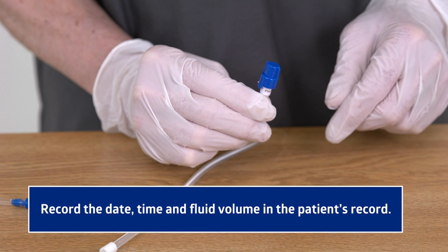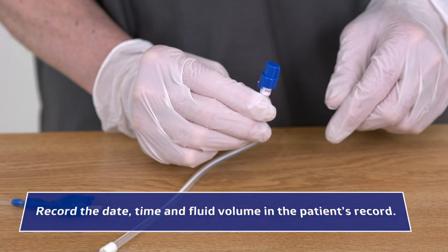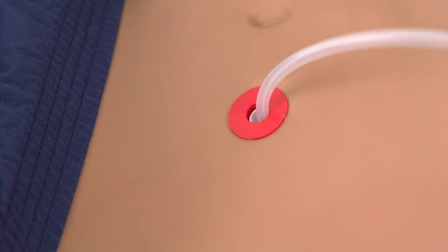Finally, record the date, time, and fluid volume in the patient's record. You're now ready to replace the dressing over the catheter.